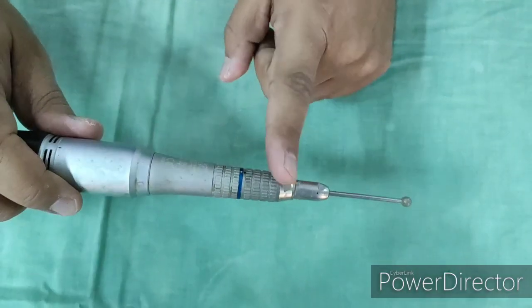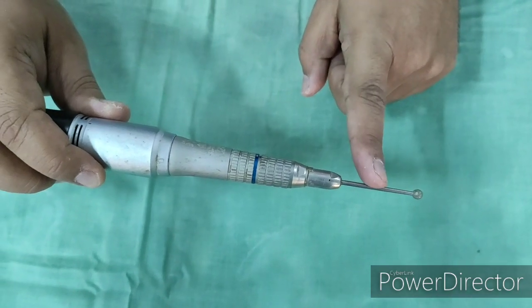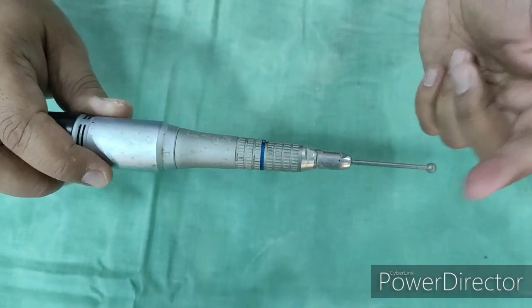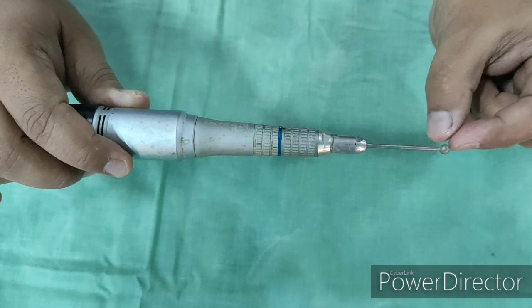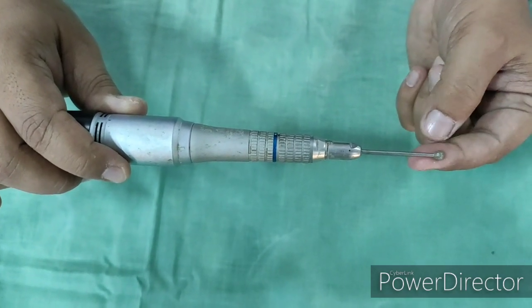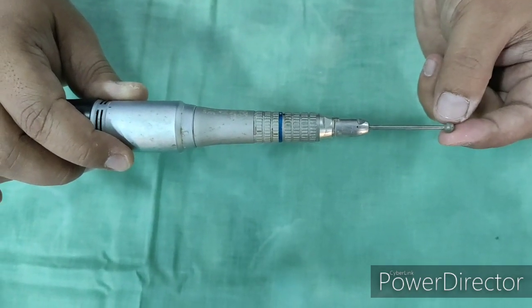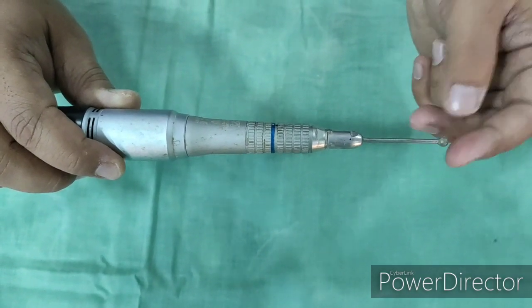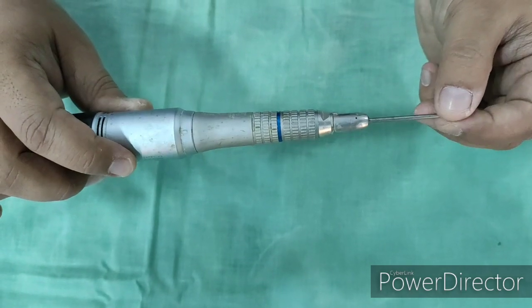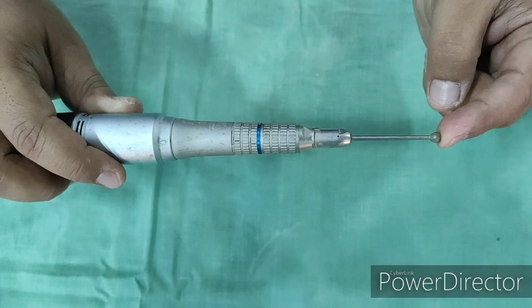Other uses of the micromotor drill besides mastoidectomy include removal of bone for ossicular reconstruction and sculpting the ossicles using a smaller-size bur. It is also used in DCR surgery to drill the lacrimal bone when the bone is thick and cannot be punched out with the punch forcep, and in mandibulectomies as well as maxillectomies to drill the bone. Thank you very much.